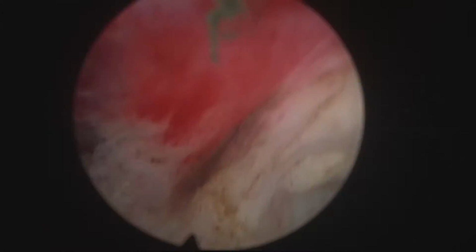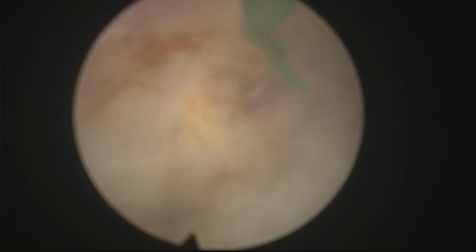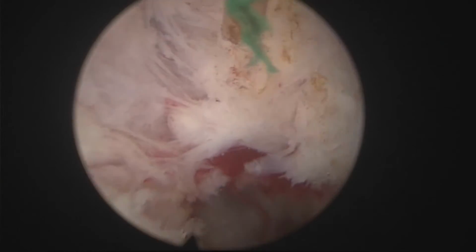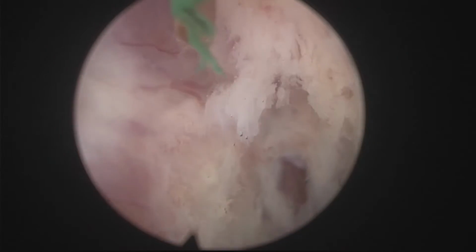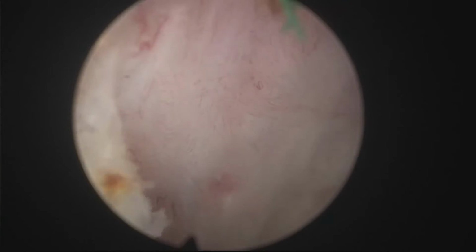So here, as you can see, coming up carefully, of course, we want to protect the sphincter completely, and to be sure that the patient will have a very good continence. And here, coming up towards 12 and trying to take the working area a little bit further inside, so we're trying to get away from the sphincter, to respect it, to stay close to the sphincter the least possible time. So here again, coming up towards 12 o'clock. This was the area that was best resected.